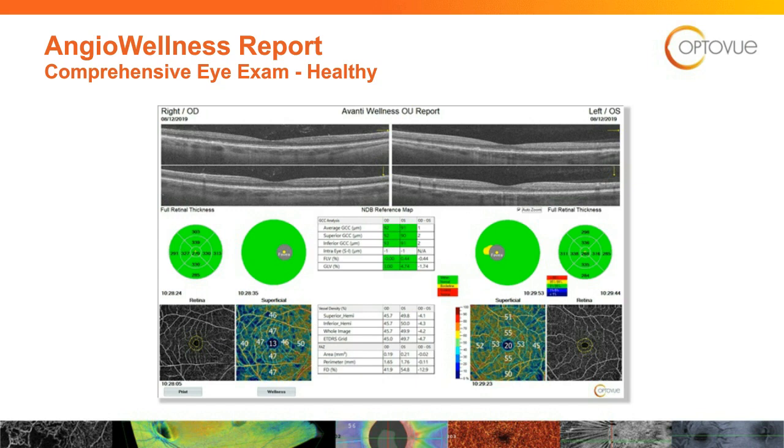We were able to do GCC and the B scan, but you can see down there at the very bottom, there's 5 boxes. The 2 at the very bottom on the outside left, outside right, that's your angio view. You can see there's 2 little yellow circles in there. That's giving you your foveal avascular zone. And what we're doing with that is really looking to see how round, make sure it's not oblong, and there are some numbers in that middle box there showing that there's excellent symmetry.